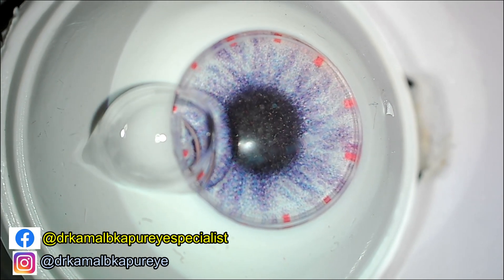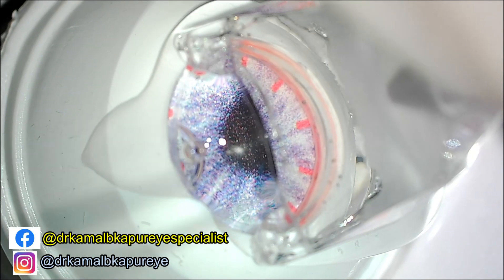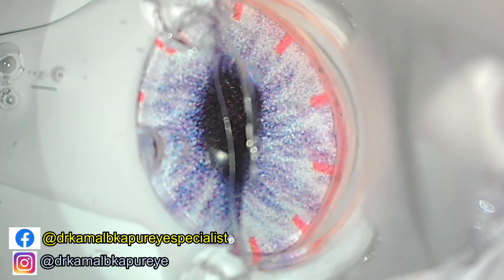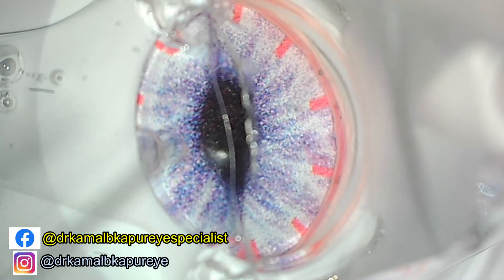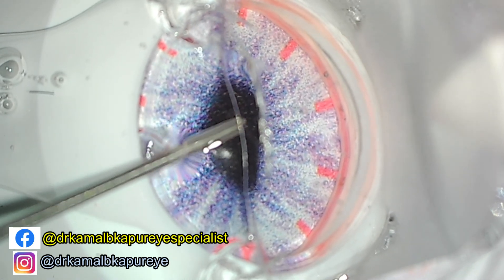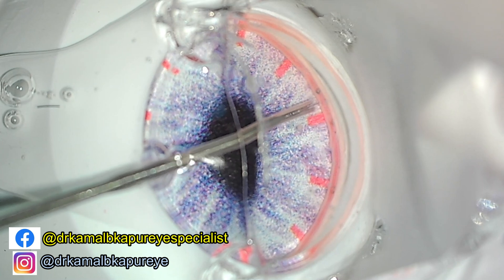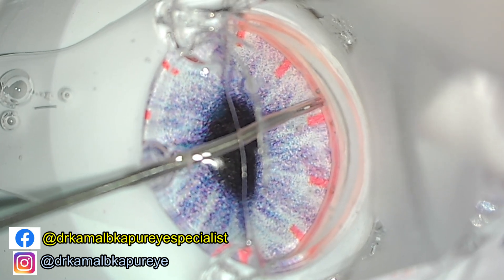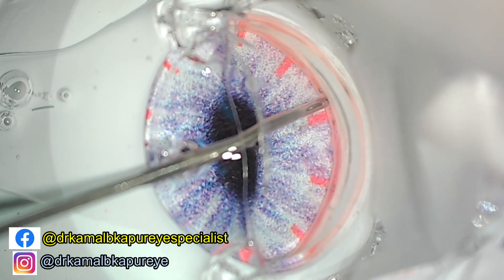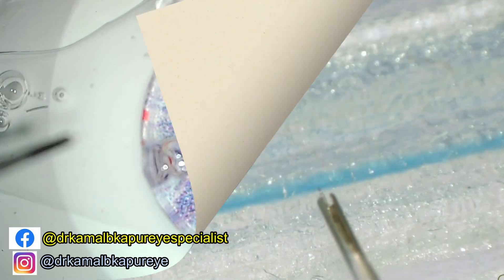We will now demonstrate in a dummy eye how it is done. We put some viscoelastic on the cornea after filling the anterior chamber. Then the prism lens, which is provided by the company, is used onto the cornea. The patient's head is tilted by 45 degrees, looking away from the surgeon.